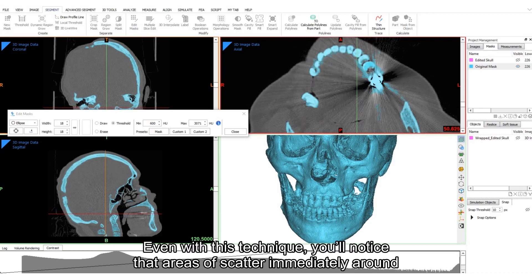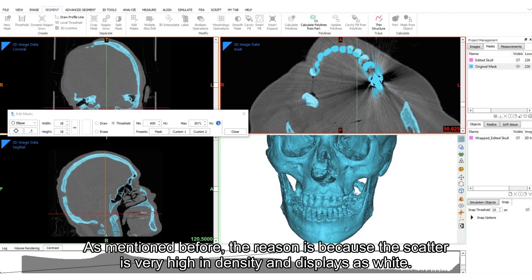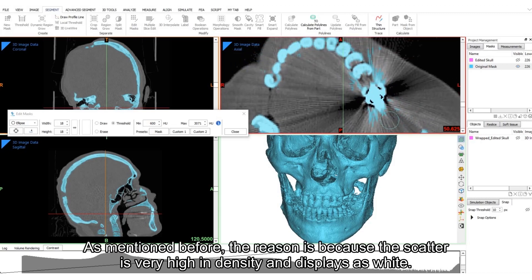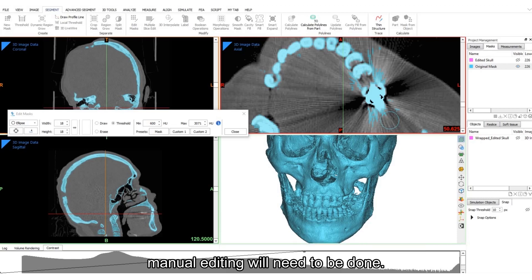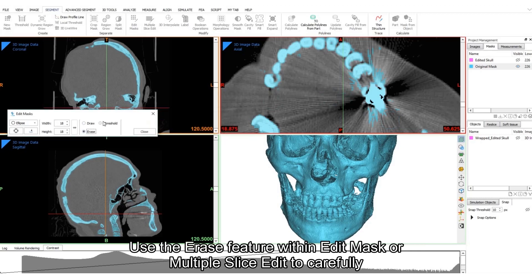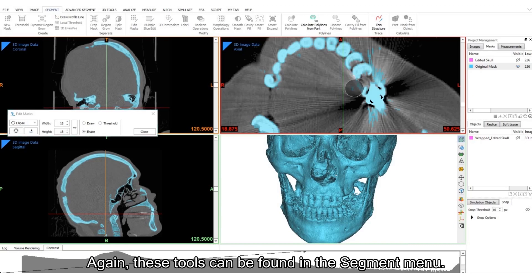Even with this technique, you'll notice that areas of scatter immediately around the dental implant are still included. As mentioned before, the reason is because the scatter is very high in density and displays as white. Because there is virtually no distinction between the implant and the scatter, manual editing will need to be done. Use the erase feature with an edit mask or multiple slice edit to carefully remove areas of scatter. Again, these tools can be found in the segment menu.